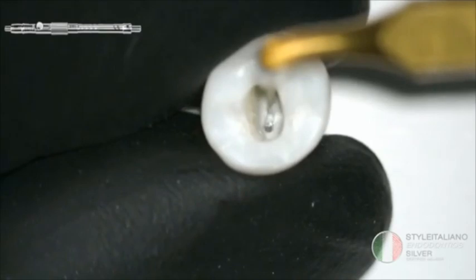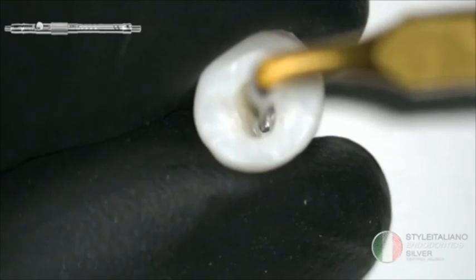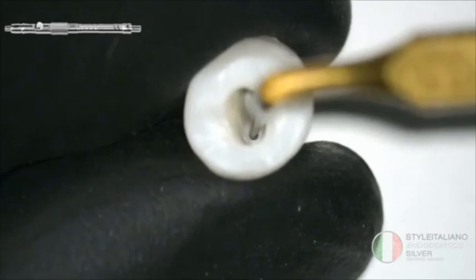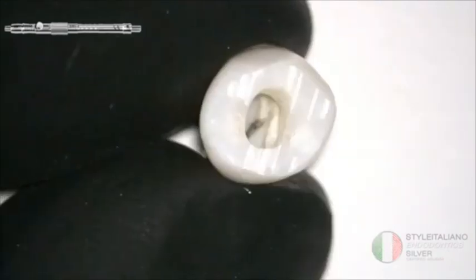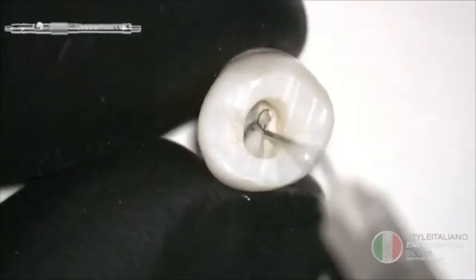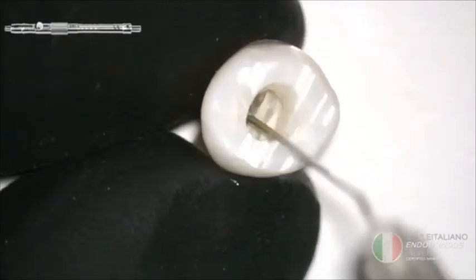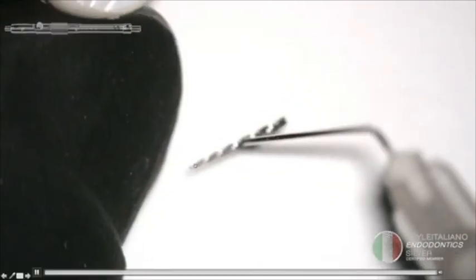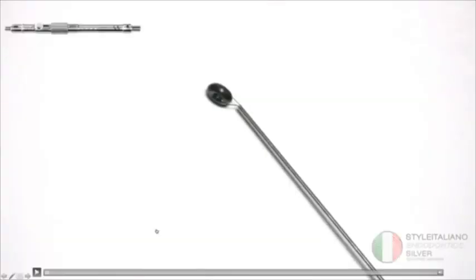Then, of course, as we said, we have to prepare the surface, the staging platform around the instrument. This is a simulation. So we have to prepare the instrument to have at least 1 millimeter length to grab the instrument. This is how we grab it and we can retrieve it. Just for informative use.